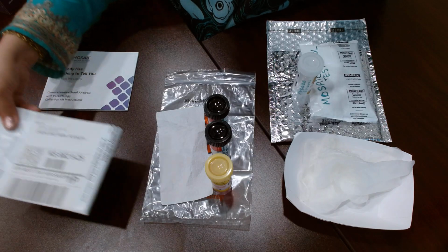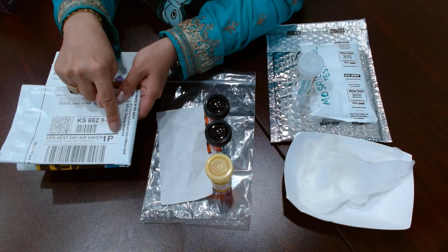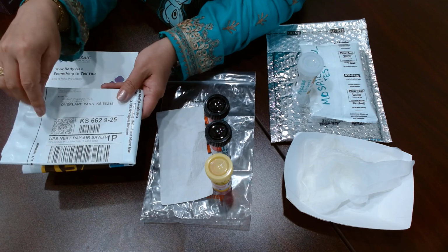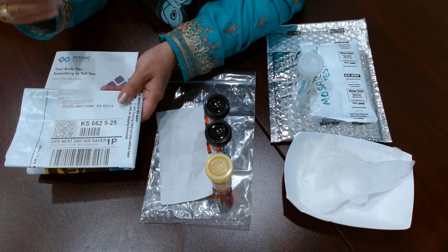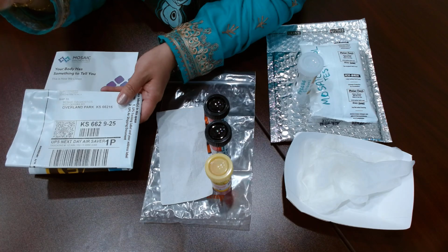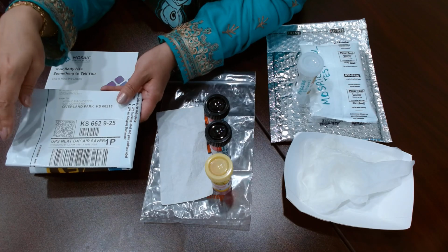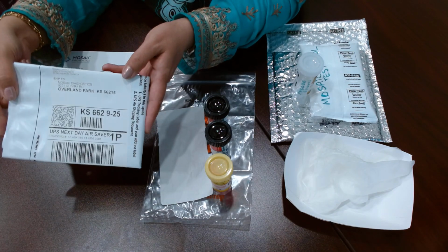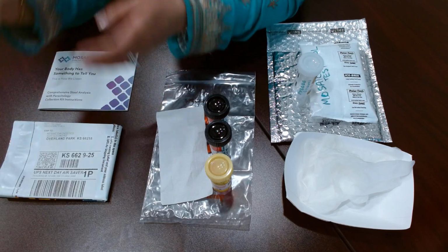You can see this is a mailing slip. I always recommend that you look at the mailer. It says UPS Next Day Air Saver, so whenever you do it, it'll be shipped. For example, if I ship it on Monday, it'll arrive on Tuesday. If I ship it on Tuesday, it'll arrive on Wednesday. Always make sure that it is received on a weekday because it doesn't say that it's a weekend delivery. So make sure that you never ship it out on a Friday.